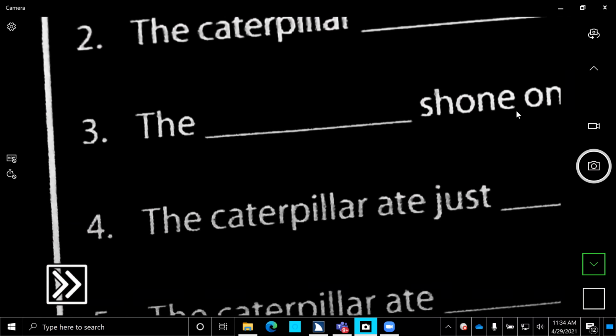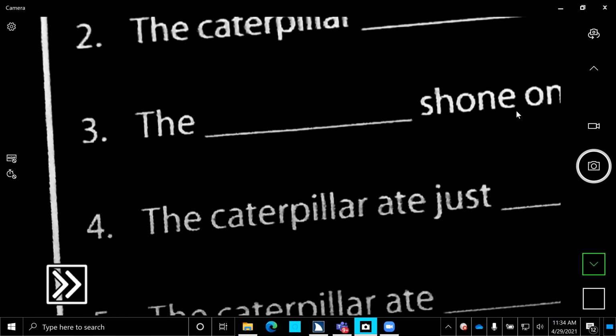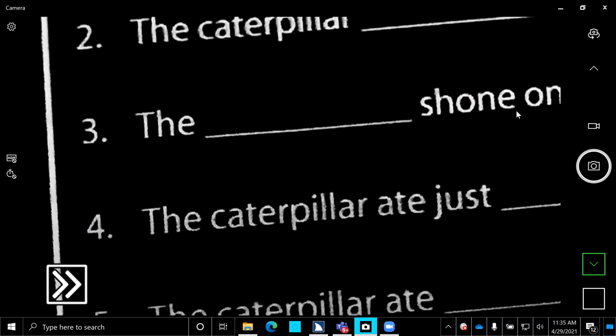But what's cool about this device is that it has accessibility features for people with super, super low vision, like myself, right? Like I've got maybe enough vision to see if I zoom in really, really significantly, I could read these words. But I can see that there's like a square on the bottom left-hand corner. I don't know, I think it's arrows, but if I touch it, it says restore button bar.